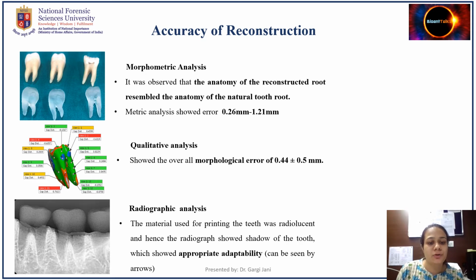And we also performed radiographic analysis where we put this 3D reconstructed tooth, that is the 3D printed tooth, in the original dental socket. So from the image, it can be inferred that there is an appropriate adaptability which can be seen by the arrows.